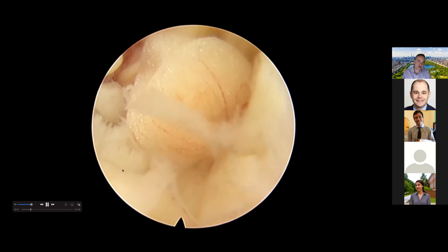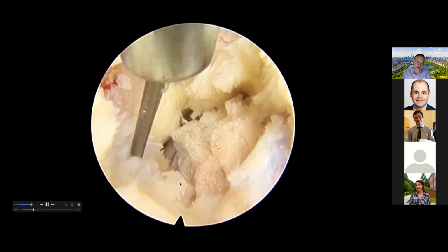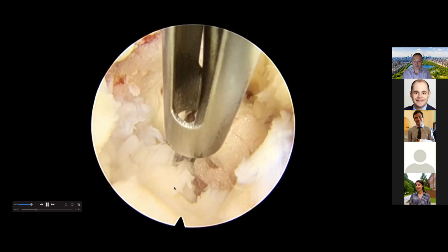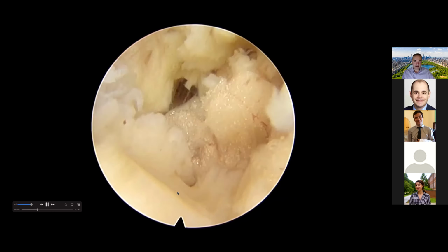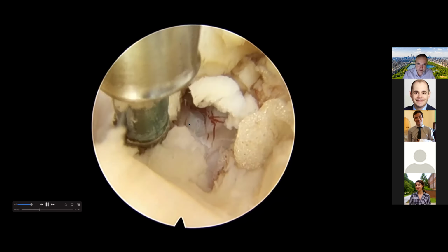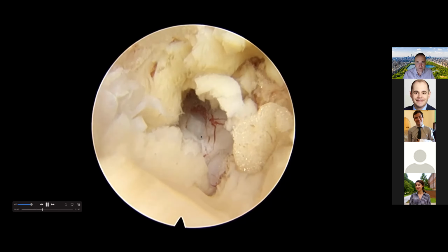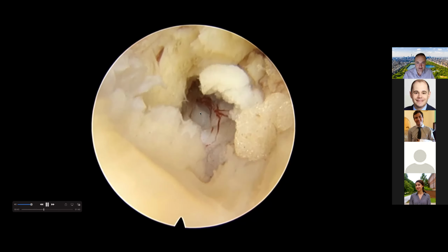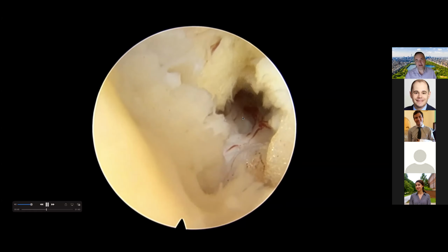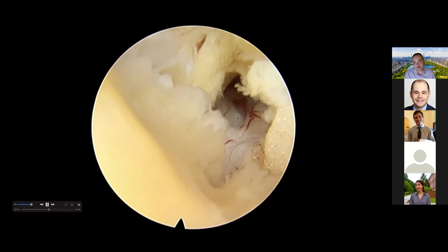So basically, the instrument, in addition to the ligament, inadvertently engaged the dura, and then also engaged a very tiny nerve root and caused a small dural tear. And over here, we're trying to expose the dural tear and visualize it. I think it was that area over here, the dural tear. You can see it here, this small defect. So here's the dura, and here is the opening in the dura that was created by the instrument. It looks big, but actually it's just 2-3 millimeters, maximum.